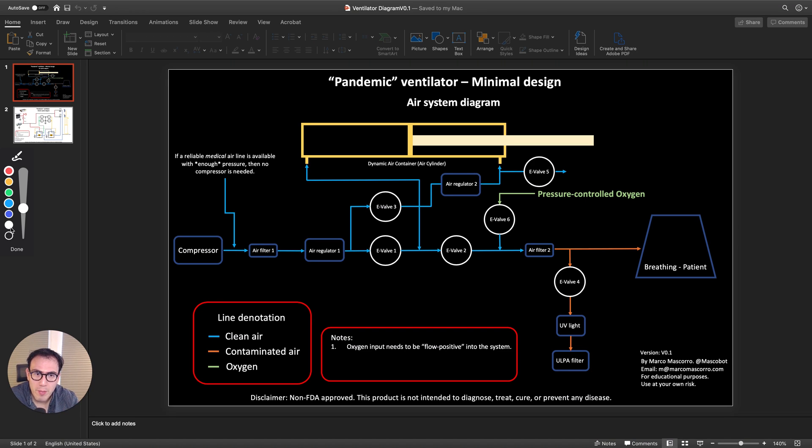The design of this ventilator is so that it can be built with off-the-shelf parts used in existing industries. One industry that has a good supply chain and can be found pretty much anywhere in the world is cars and trucks. You find them everywhere — there are local shops that sell spare parts as well as online stores. Everything I use here I literally bought on Amazon.